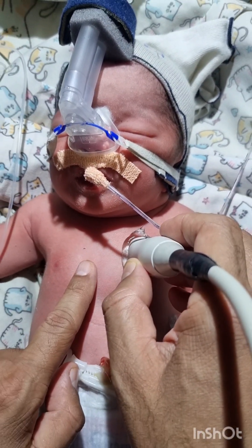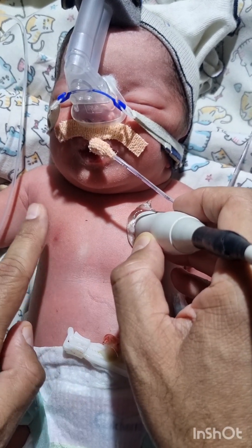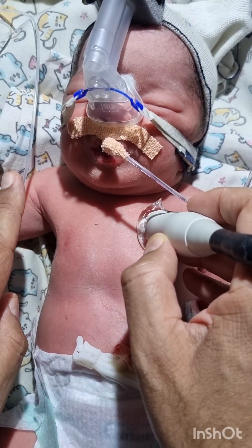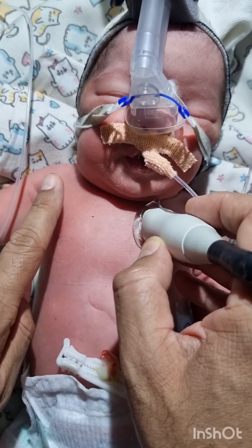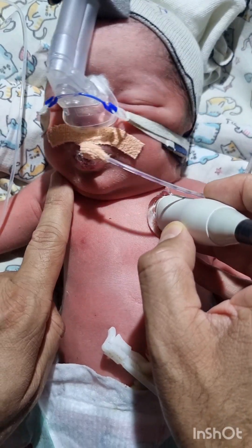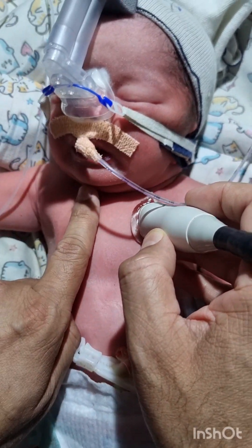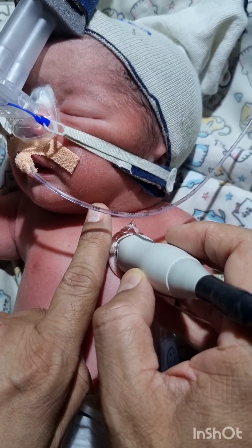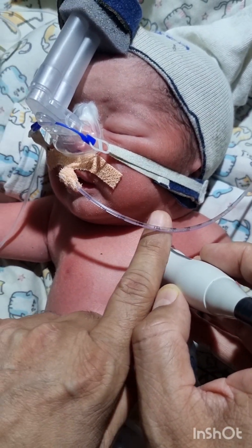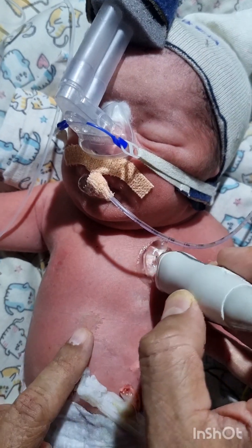The arrangement of the vessels is: SVC is on the right side, then is the ascending aorta, then on the left of the sternum is the pulmonary artery, then is the descending aorta.